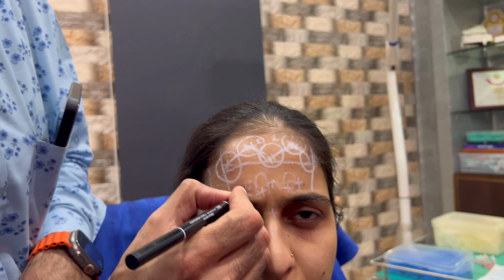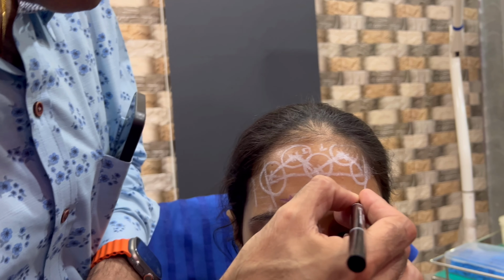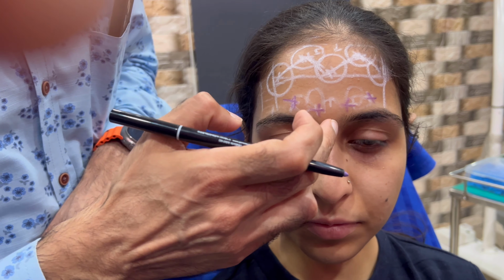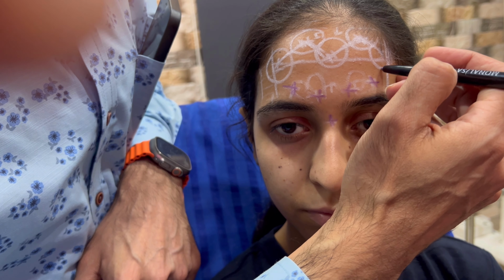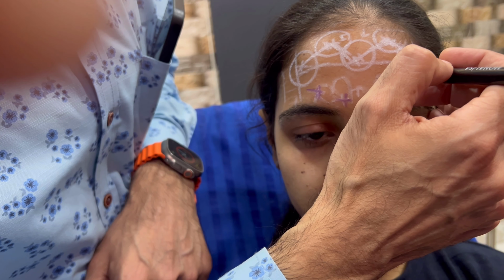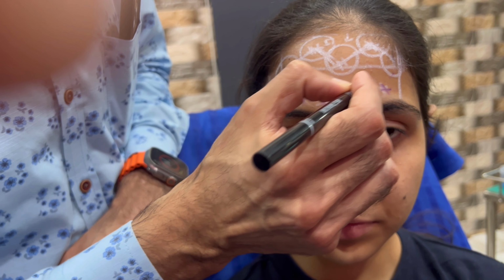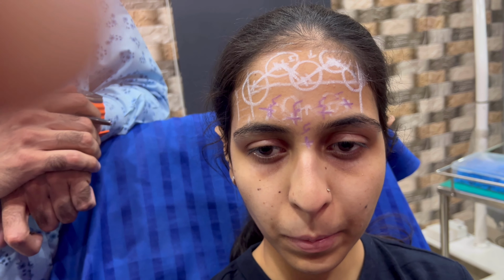So this point is 1 point, second point, 1 point, second point, and the central point. Here I have kept it at the nasofrontal angle because I don't want to go above that, right? I don't know where the frontalis and the procerus will merge. Also, I want to make sure these 2 points are not sitting one under the other. So there is a reasonable gap from this line; I have stayed medial to that line. Again, 4 units per point. 4, 4, 4, 4 and 4. Right? To treat the corrugator complex.